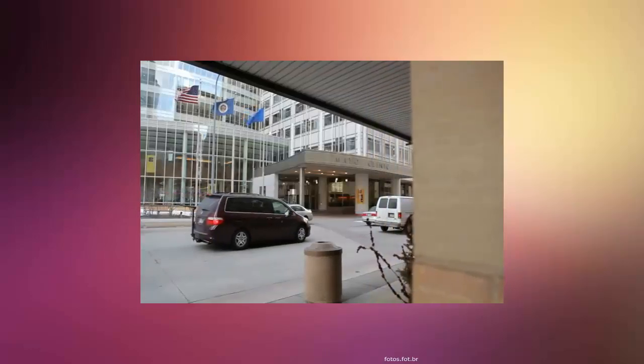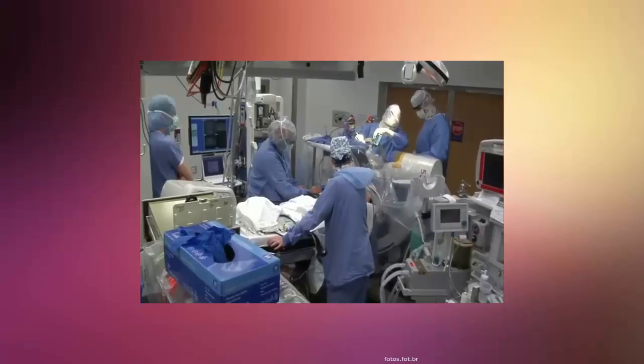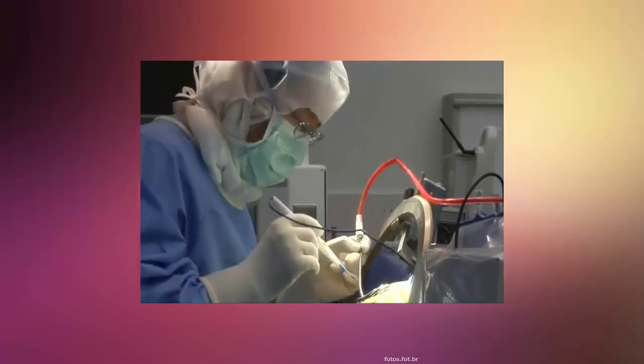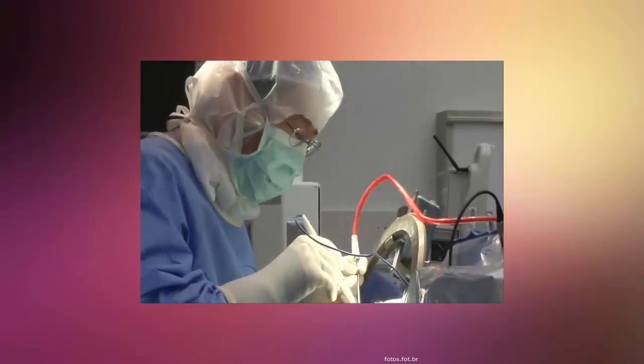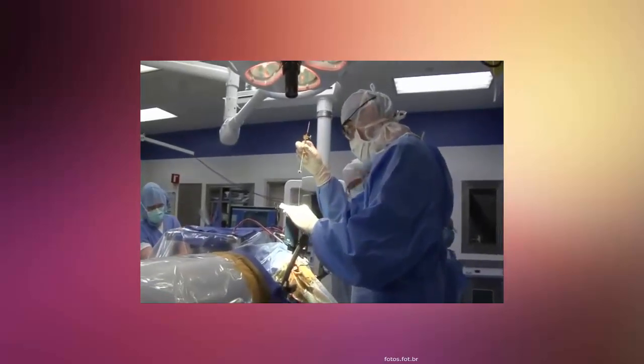Concerned, he went to Mayo Clinic, where he met neurosurgeon Dr. Kendall Lee. "And the amount of tremor he has would be considered pretty mild, but not in the case of a concert violinist." Dr. Lee and Roger agreed that deep brain stimulation, or DBS, was their best chance at stopping the tremor. It involved placing electrodes into Roger's brain.